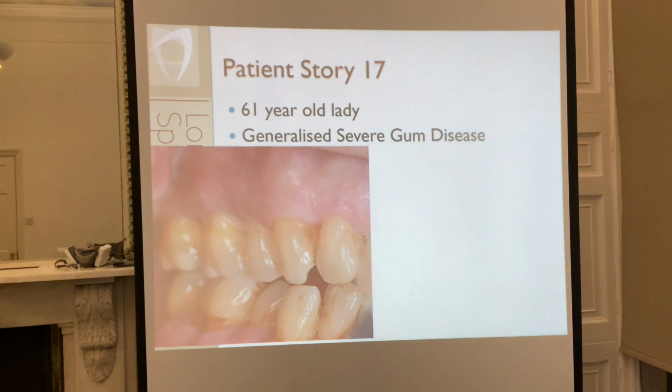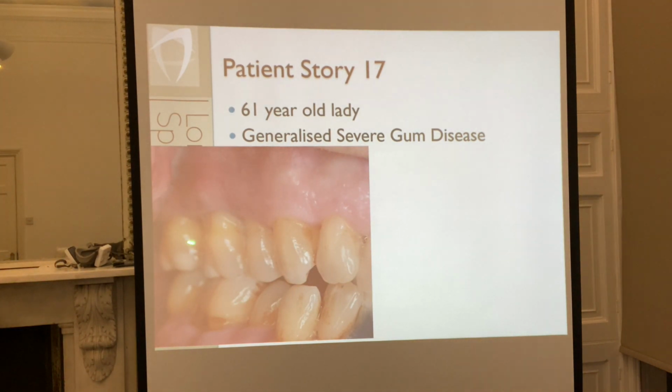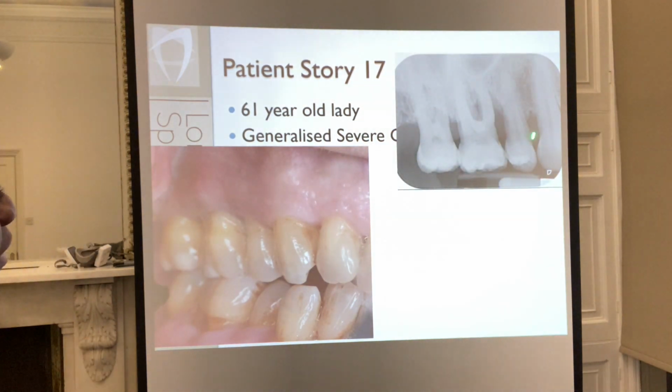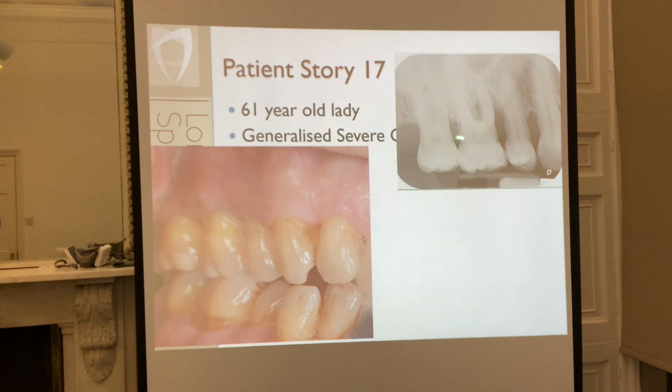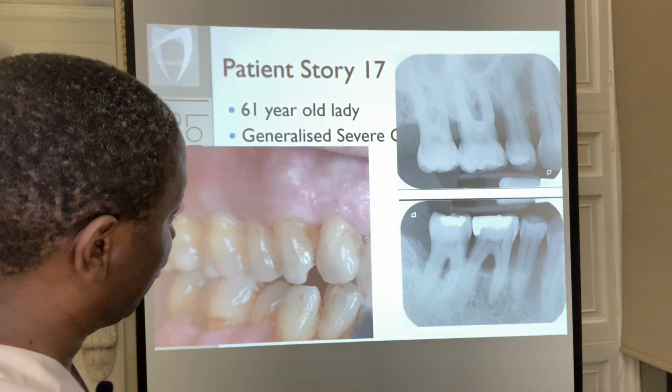So this is a picture of the right side, and the main issues are around these big chewing teeth, they're called the molar teeth, on the right side, on the top right and the bottom right. And let's look at the X-rays. This is an X-ray of the back 3 or 4 teeth on the upper right, and this is the X-ray of the last 3 teeth on the lower right as well.